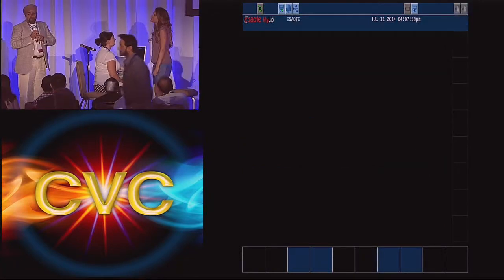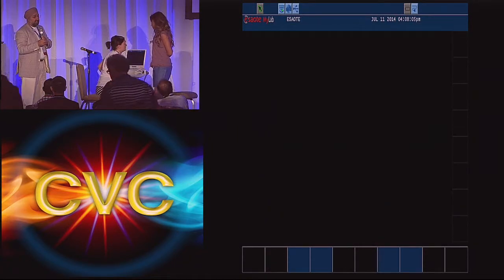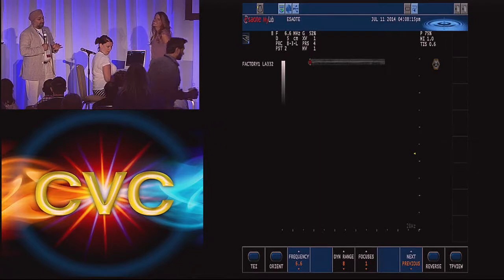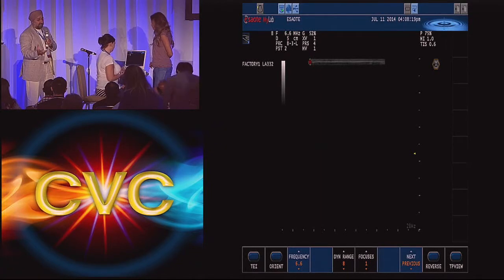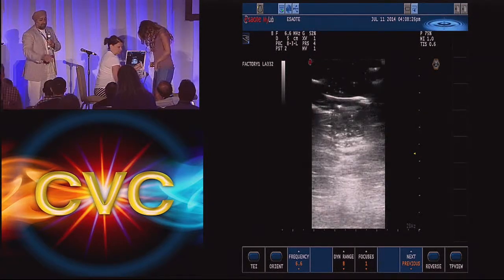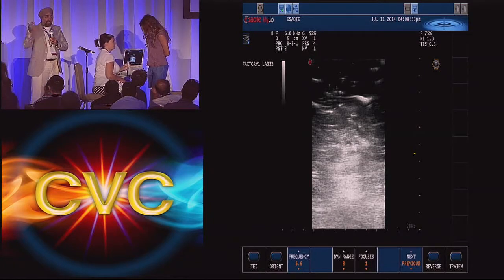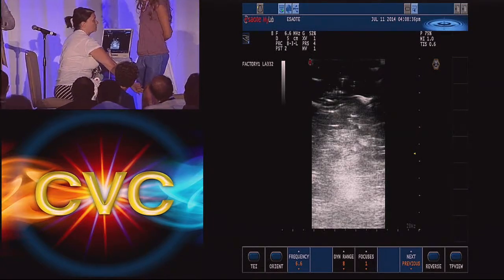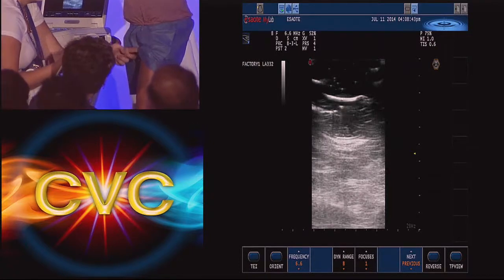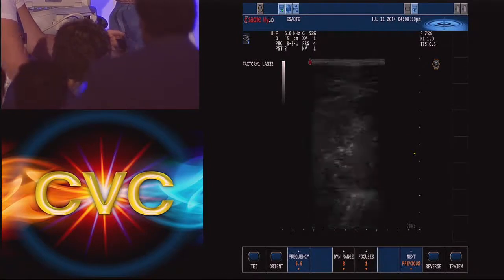While doing the procedure, your ultrasound skills are really what set you apart, especially when you're getting access. The secret of treating superficial venous disease is the following: all the problems are from increased ambulatory venous pressure. Normally at the ankle, when you're flat, supine, it is zero. The minute you are vertical, whether sitting or standing, the pressure starts going up. If your calf pump works, it keeps draining it out, and 20 to 30 is the baseline. If reflux occurs, you have to find out where it is, and that's what ultrasound helps you with. You cannot rely on just an ultrasound report. When you're doing the procedure, the ultrasound skill is what makes the difference.